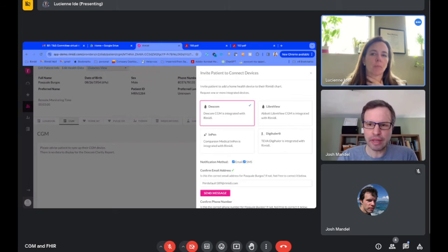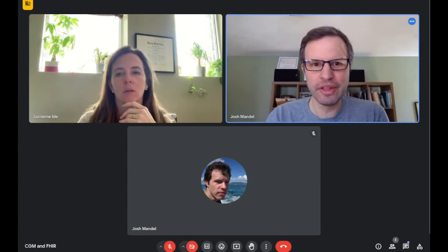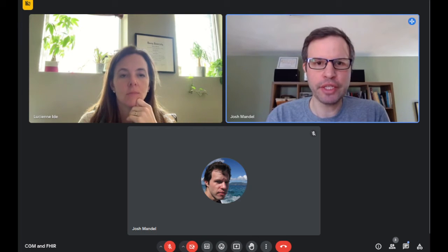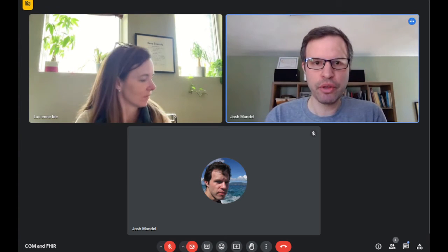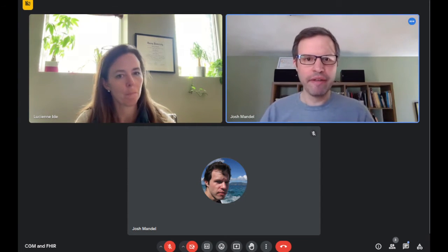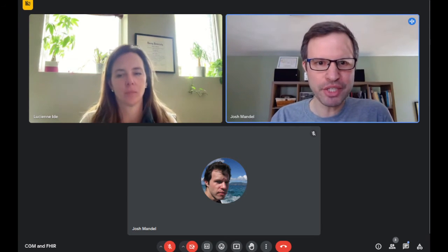So from my perspective that's actually a pretty nice workflow in the sense that it's at least consistent, especially if the patient is in the clinic and there's somebody who can walk them through the challenging steps there. We did hear on a call last week from the Redox team about integrations that they sometimes do where there were two stories. One was, I think, the Abbott app will generate a 16-digit code that the patient can then give to the provider to establish authorization. I'm guessing that's sort of equivalent to the OAuth flow, but just involves more manual hops.